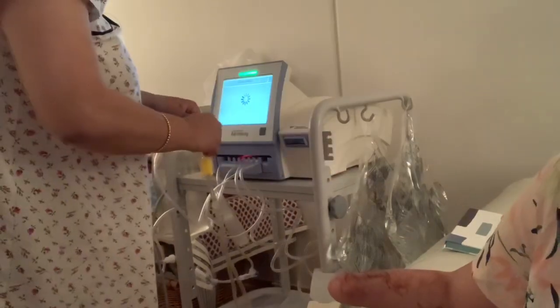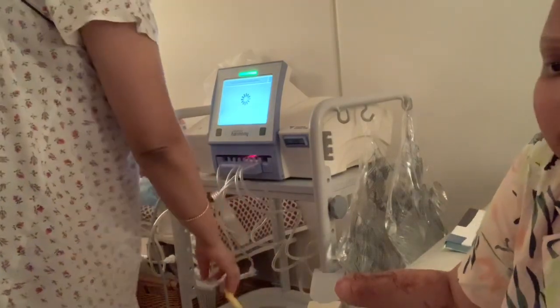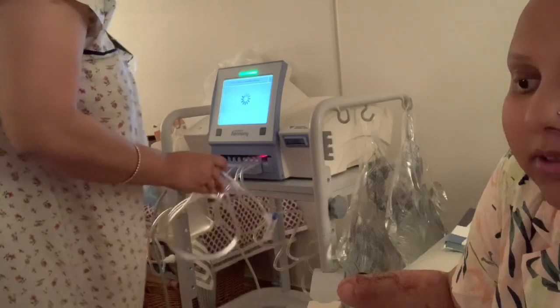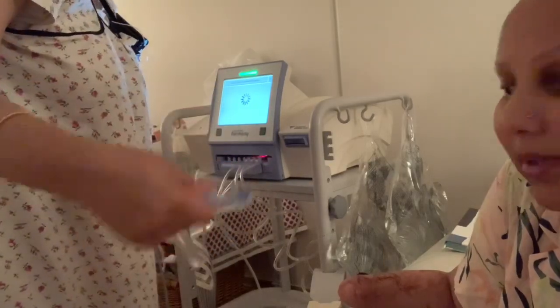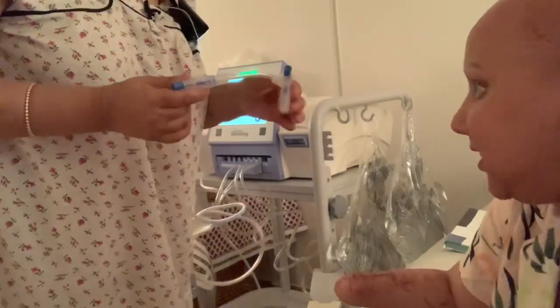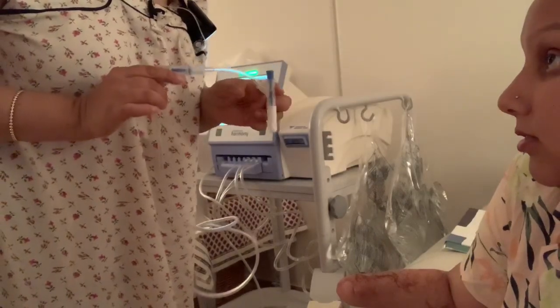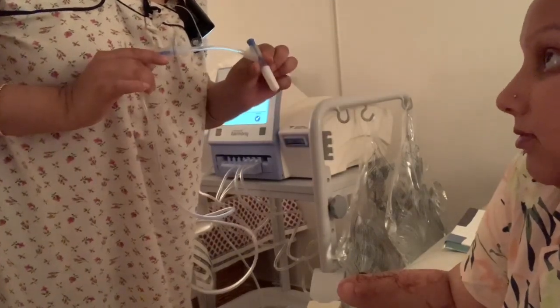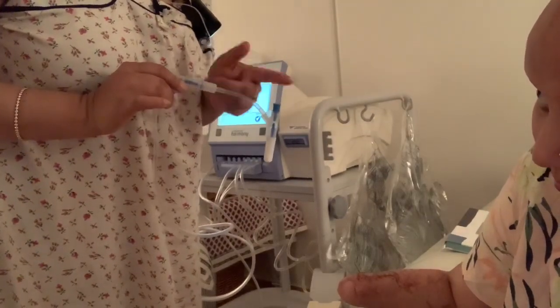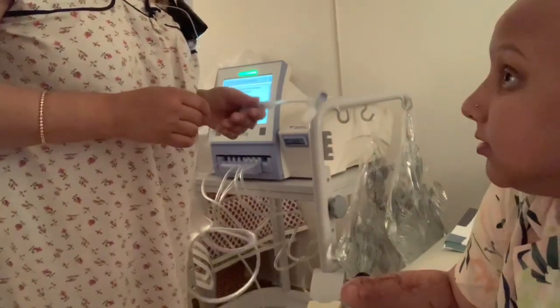Now we're connecting the bags — just like in the manual one, there has to be a bag to collect the toxic fluid that's been drained out of my stomach. It drains into two bags. There's also one that will go into my body, and a second one in case I need to get up in the middle of the night.